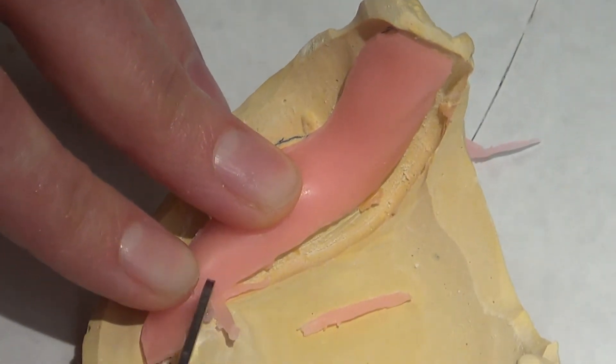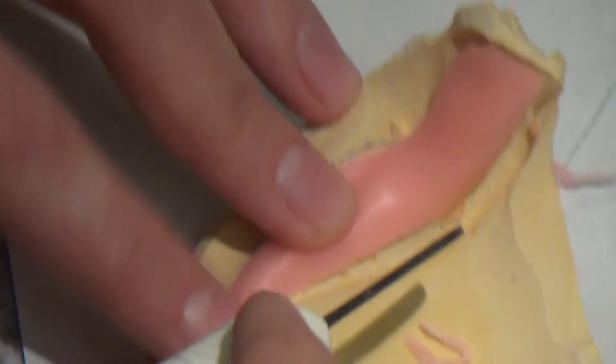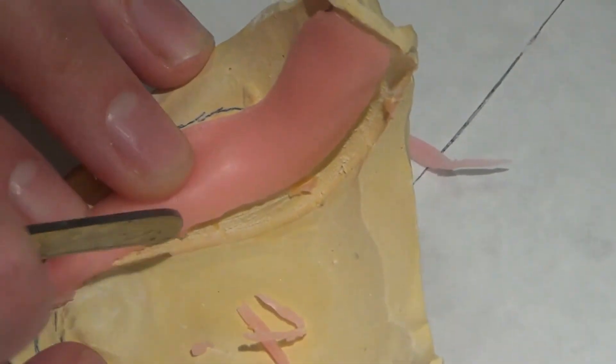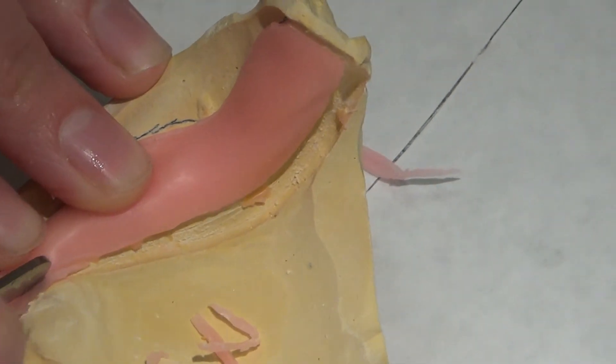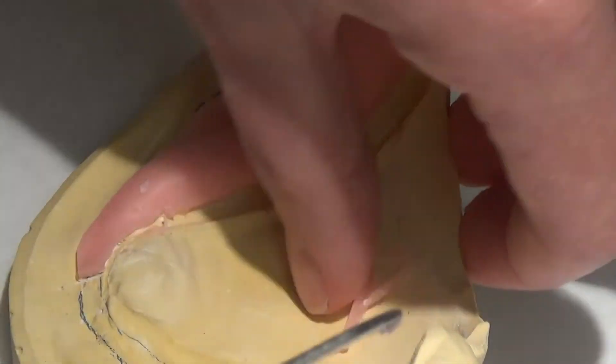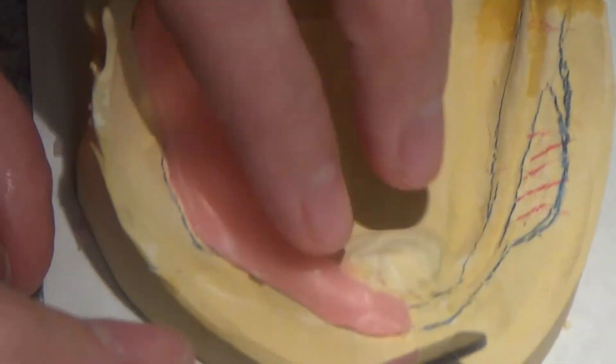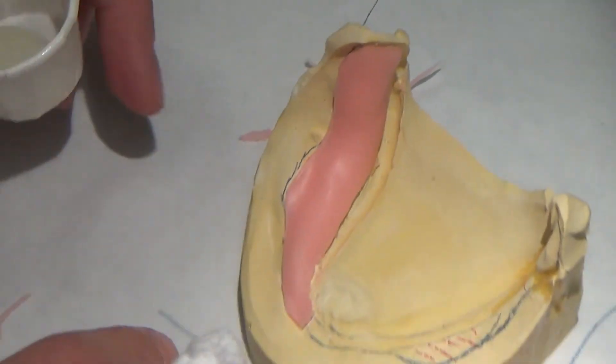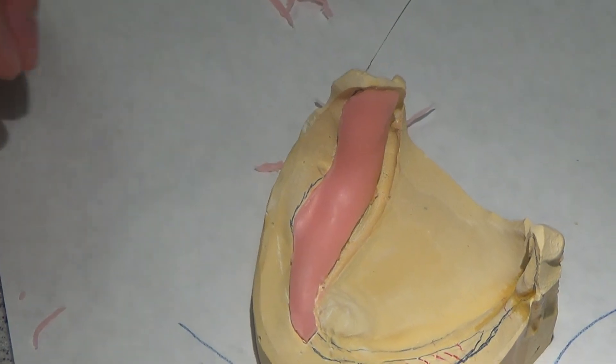That doesn't mean that it's going to make her happy when she spends a lot of money on a denture that I make her that doesn't fit well. So, I need to maximize my efforts to make this work well for her. Okay, so you can see I've covered my anatomy. I'm going to take a quick break from this. I'm going to go over and finish the tray curing on the maxilla.